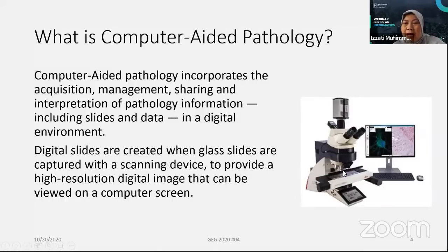In this area there will be the slide, and usually we see it through the ocular optic here, and on top of that there are some microscopes that have a coupled CCD camera, and from that we can see what is seen here through the computer.